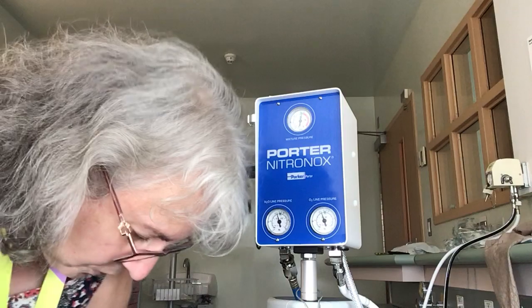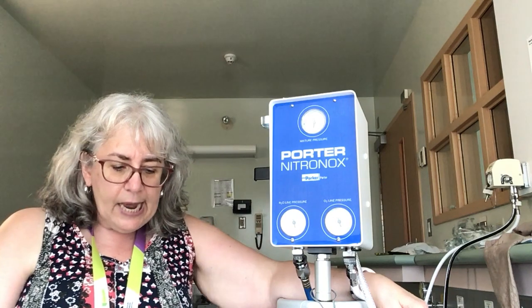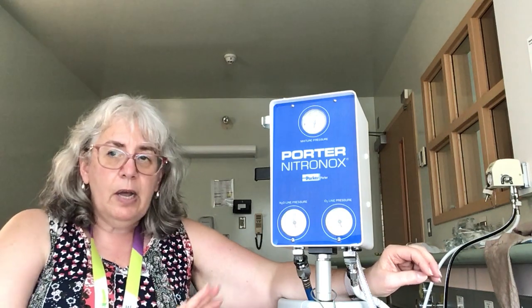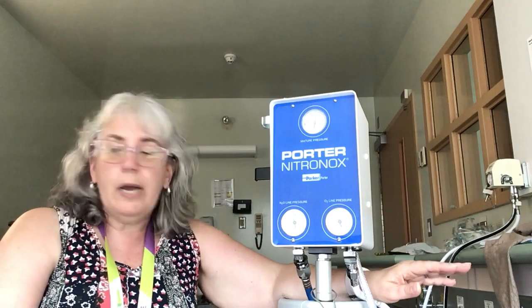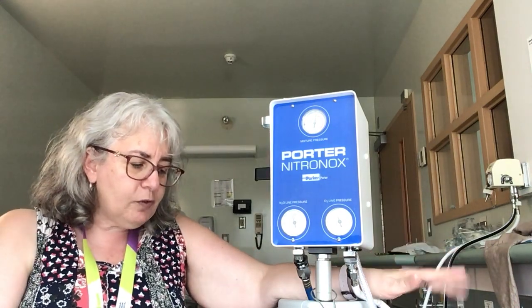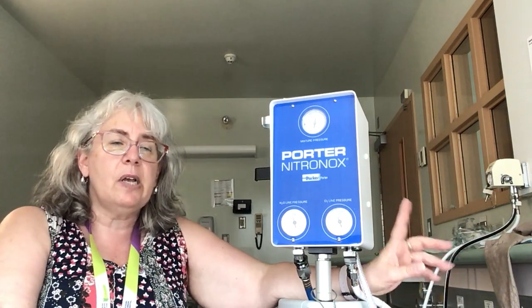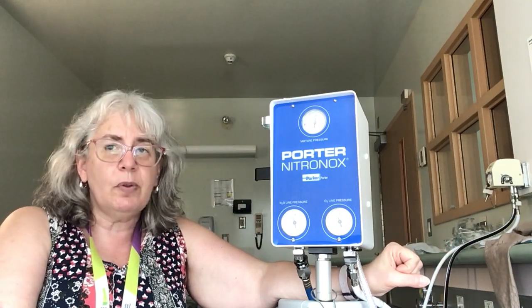We also have a process in place with our respiratory attendant, who is here on weekdays only, between 8 and 1400, 3 times a week. He's going to check all of our pressures, change tanks as required, provide more masks, filters, scavenging tubings, etc. So we've got that built in. As I said, we have 2 tanks of each nitrous oxide and oxygen on each unit, plus we have 2 tanks of nitrous oxide extra on our FBC, as well as extra oxygen. So I don't think we'll be running out.